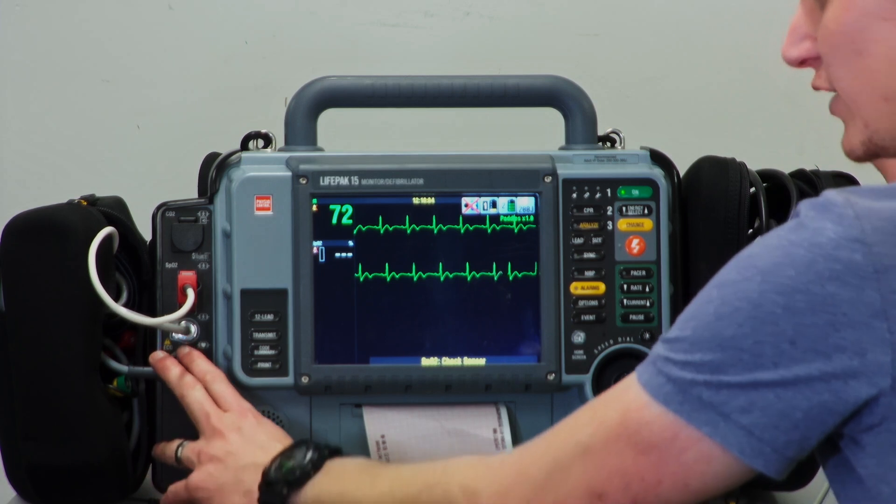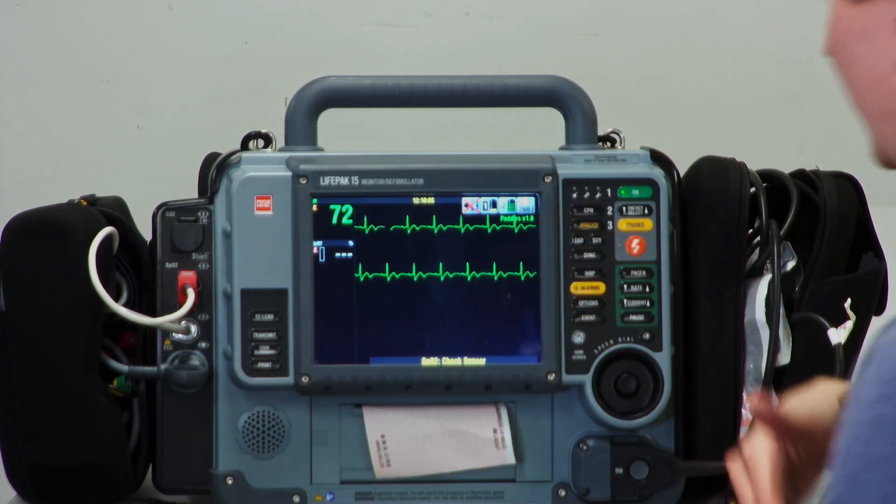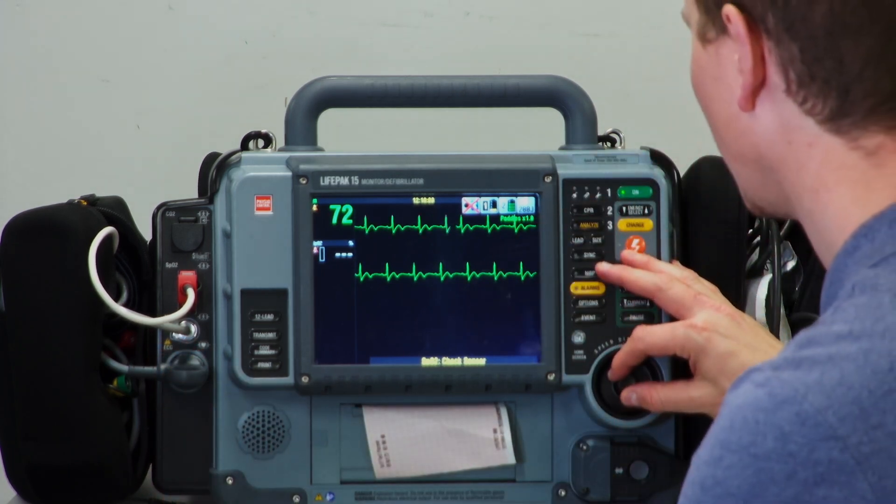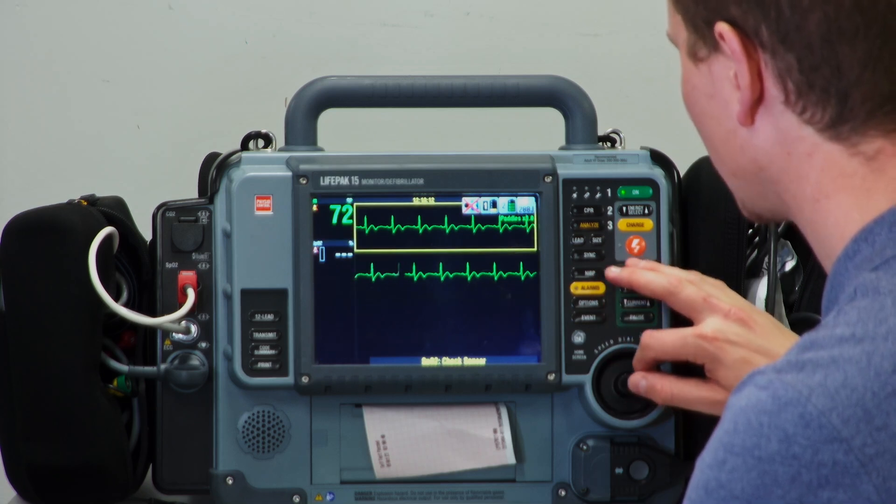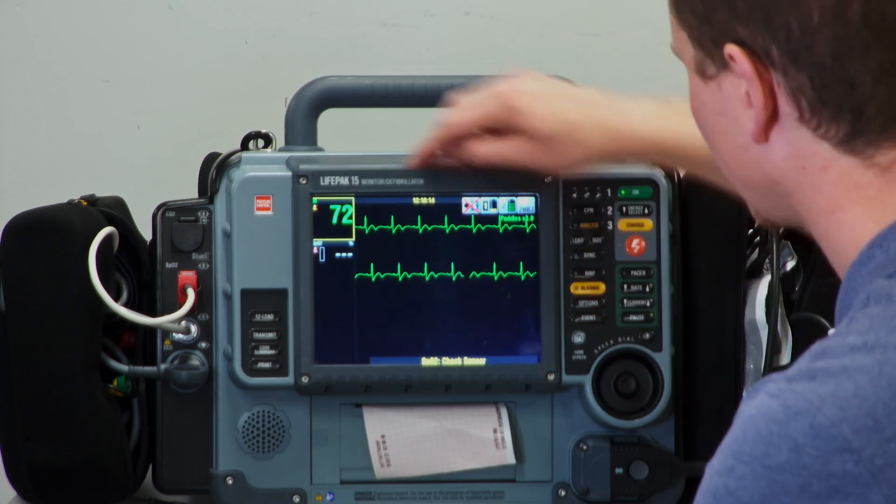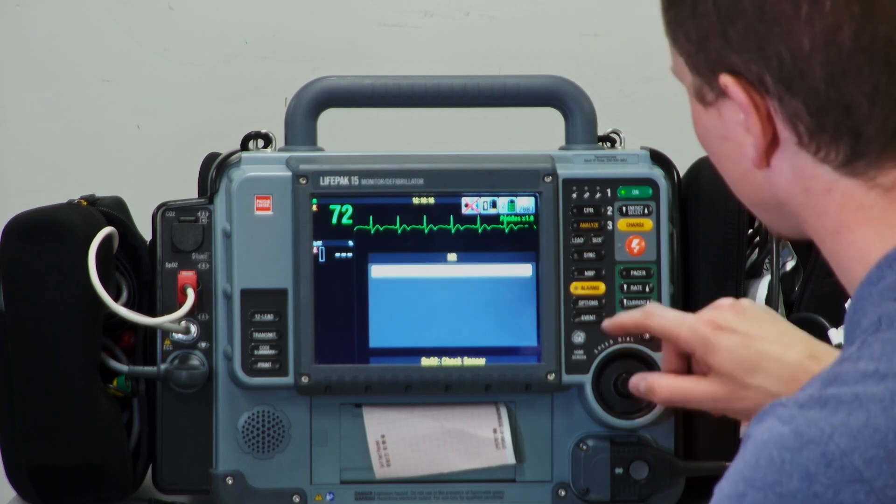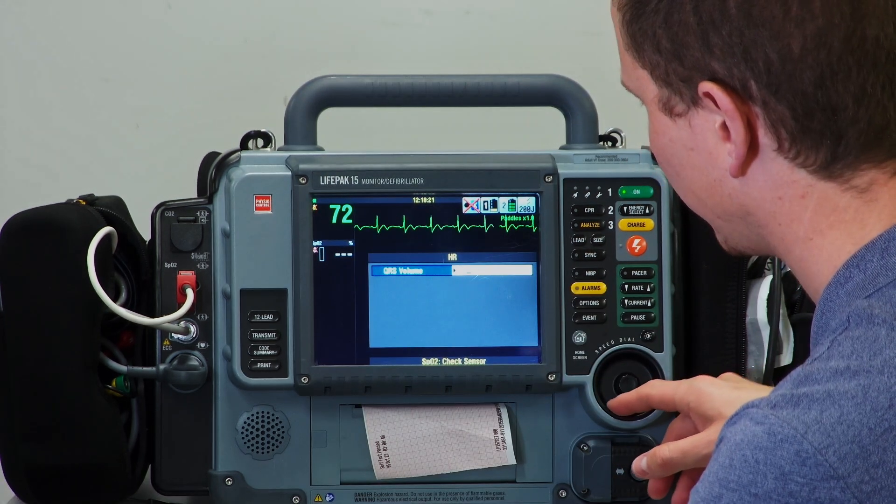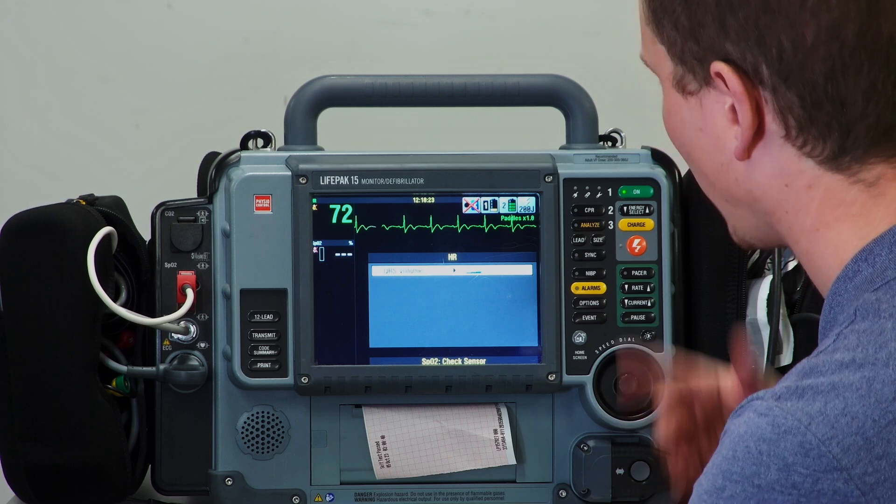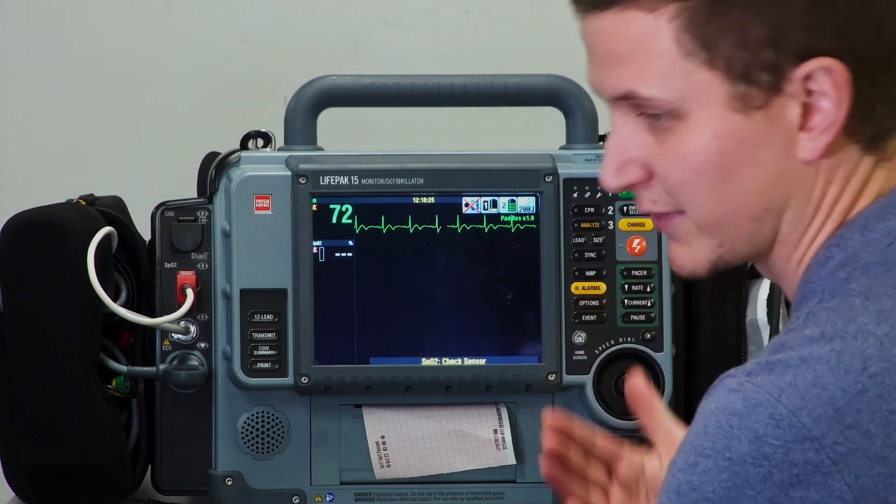From that point on we can start to turn the knob and you can see we can control things. If I select at the top, if I put it over the heart rate and select heart rate, it says QRS volume. Now there is no QRS volume, but if I increase it we can now hear the rhythm that's being generated. We can turn it off.